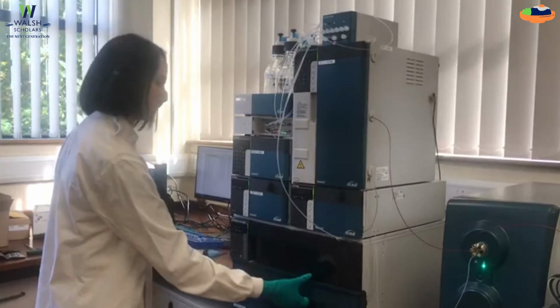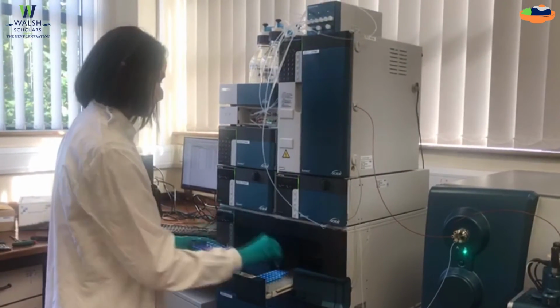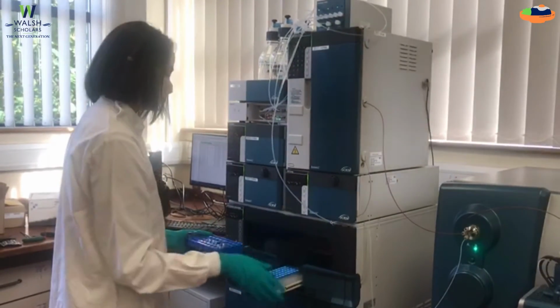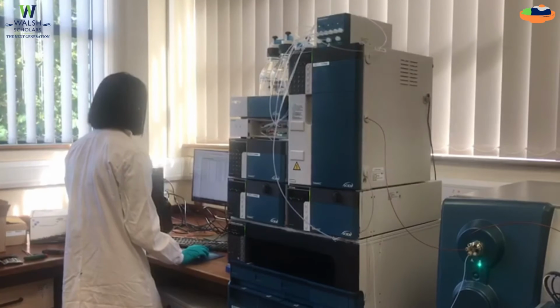Since their ban, the majority of methods for nitrofuran analysis have focused primarily on just 4 main compounds, and the analysis has been very time consuming. So the objectives of my work were to extend the scope of nitrofuran analysis and also to reduce the sample turnaround times. So in my work, I've included an additional 4 nitrofuran residues. So now my method detects 8 nitrofuran drugs as opposed to 4 drugs.